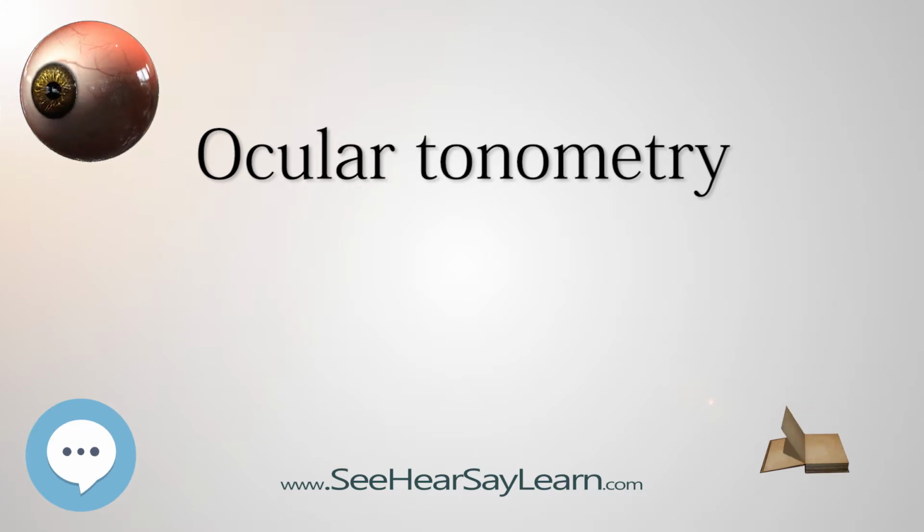Non-corneal and transpalpebral tonometry. Transpalpebral tonometry refers to methods of measuring intraocular pressure through the eyelid. The Diaton non-corneal tonometer calculates pressure by measuring the response of a free-falling rod, as it rebounds against the tarsal plate of the eyelid through the sclera. The patient is positioned so that the tip of the device and lid are overlying sclera. Non-corneal and transpalpebral tonometry does not involve contact with the cornea and does not require topical anesthetic during routine use.